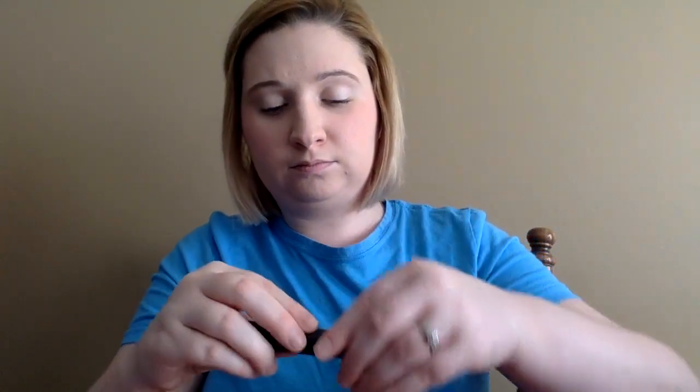All right, let's screw it back on. Let's try this. I think they have a 3.5 too. Oh, felt that. That kind of hurt. Okay, get the blood out, and we're gonna put it on the strip. Oh, let me make sure I have enough blood. Okay, we're just working this out right here.